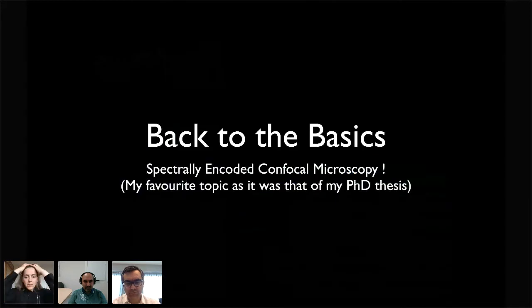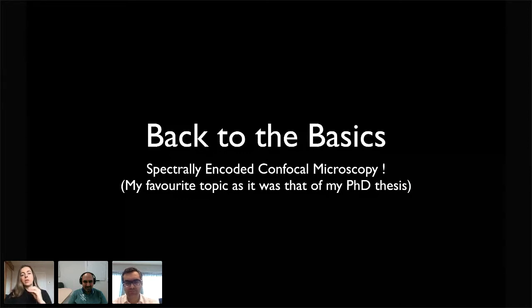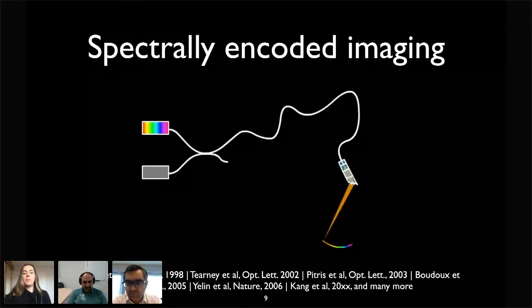So back to the basics, back to my favorite topic, my PhD thesis topic. Let's start with one example where we started with an idea to very rapidly go to the clinics, learn from the clinics, and then come back and say, what can we improve on? So an idea here was to perform rapid imaging within the body using the smallest instrument. And if you're trying to do imaging, one of the challenges is how can you miniaturize the scanner at the tip of your instrument?